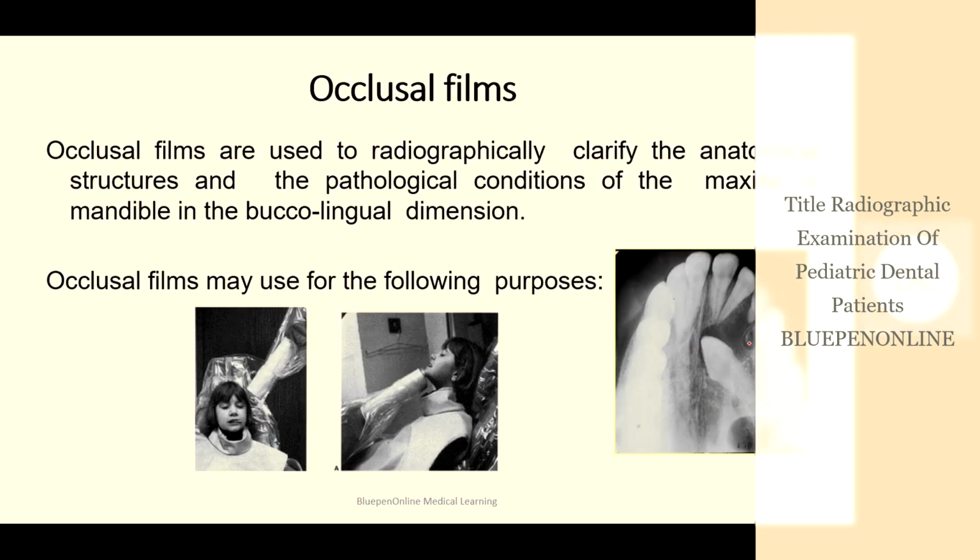So here we can see this is one of the occlusal film of maxilla. So in this the impacted canine can be seen.